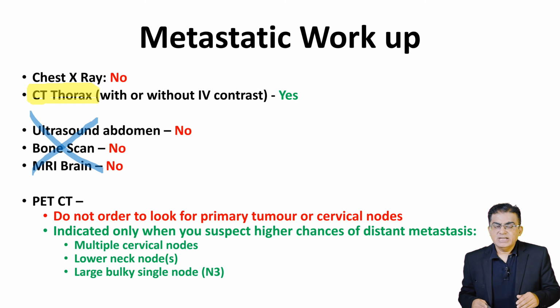Now let's talk about the elephant in the room, the PET-CT. This is a huge misconception out there right now. Since PET-CT is available in every city these days, I see people ordering a PET-CT for almost every new oral cancer patient because they think it is the ultimate all-in-one stop solution to evaluate primary tumors, cervical node and distant metastasis. Please stop doing this. Do not order a PET-CT to look for the primary tumor or to stage a clinically negative neck.